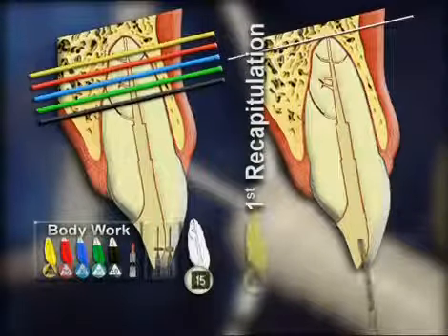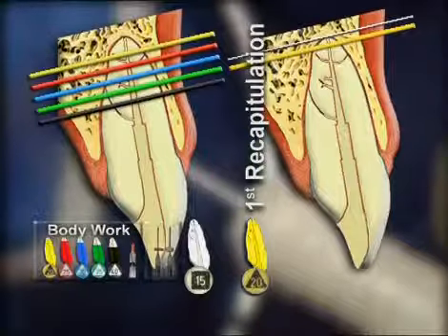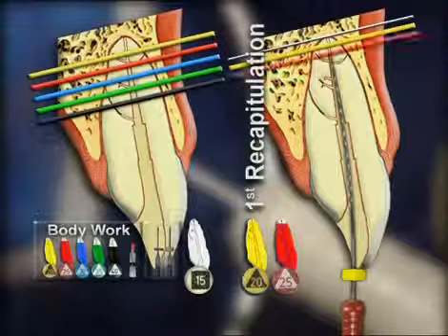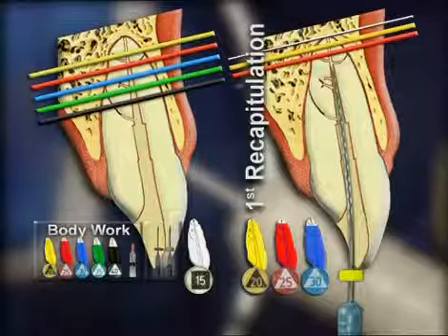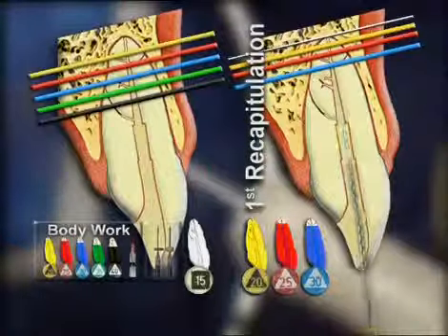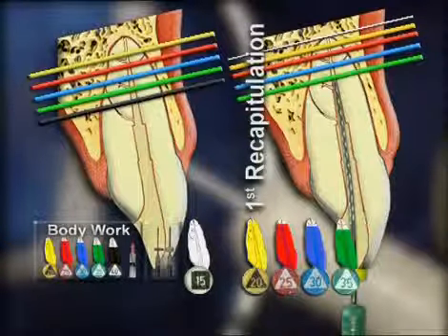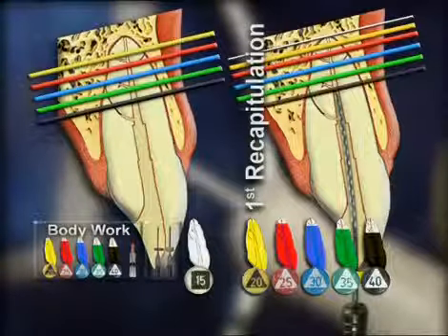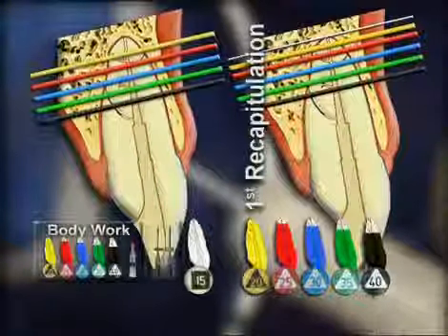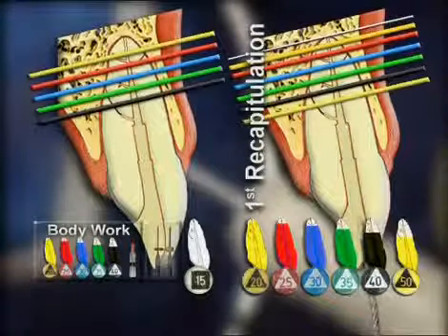We irrigate, reintroduce, and reapply every reamer in the series previously used, in most instances without any pressure. Each reamer can be advanced closer to the apex than in its prior use, before making contact with the canal walls and receiving one half turn. This finally creates the desired continuously tapering conical shape, developing suitable access for delicate preparation of the apical portion of the canal.